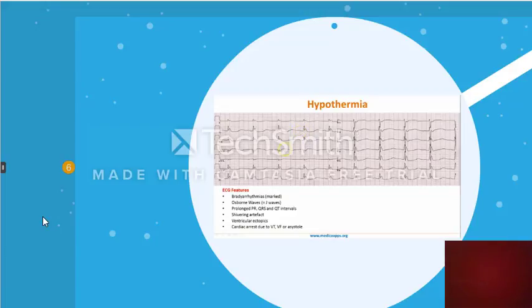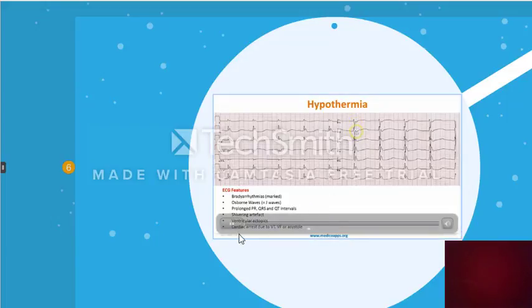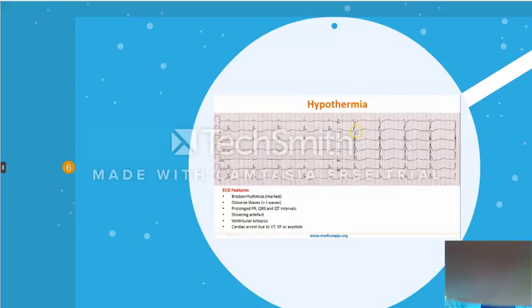Also, if there is severe hypothermia, you can find shivering artifacts. In this one you are not seeing shivering artifacts, but you can see them. So this is a typical ECG of hypothermia, where you see the J waves. This is the J wave, a slight positive deflection. In the case of V1 or V2, the deflection would be toward the negative.